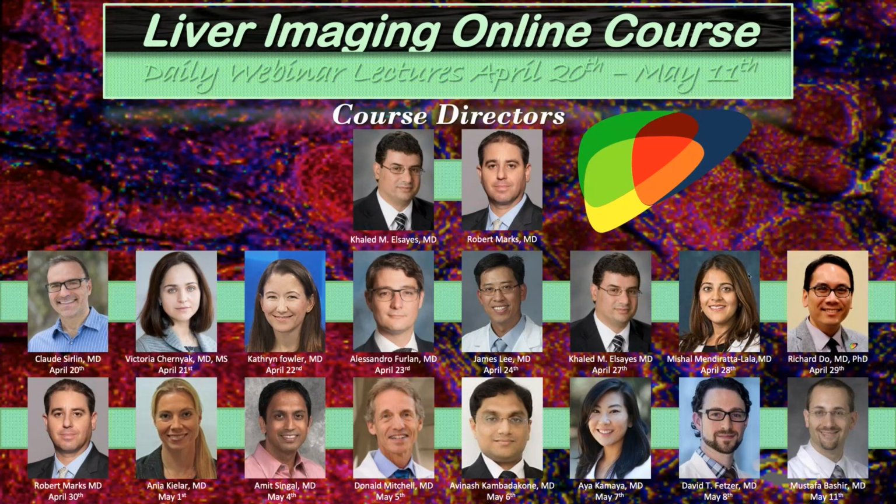There's a few other ancillary features, but it's probably the biggest challenge. Probably the most important thing is keep LI-RADS M in mind. Don't be too tempted to see arterial phase hyperenhancement washout and just stop there. Think about LI-RADS M and decide whether there's anything else about it that makes you doubt hepatocellular cancer. Did that help address your question? Yes. Thank you very much.